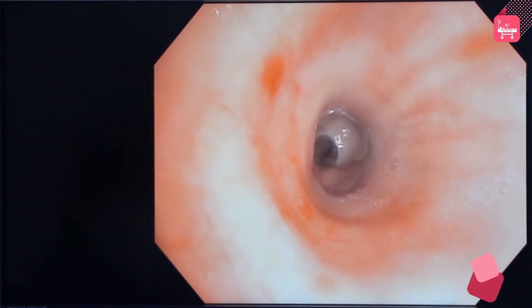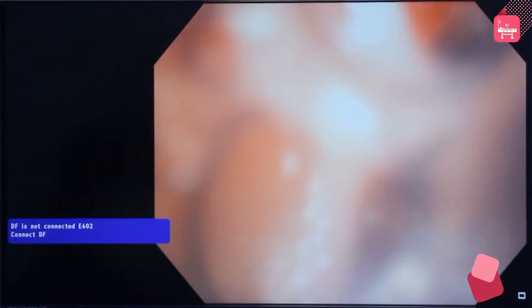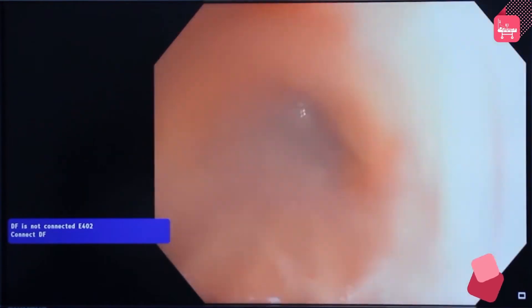On completion of the examination on the right side, insert the bronchoscope into the left bronchus slowly by visualizing on the monitor. For clear vision, instill a small amount of saline into the catheter. Once you go inside, the left upper lobe is visible, which has thick mucosal crusting.